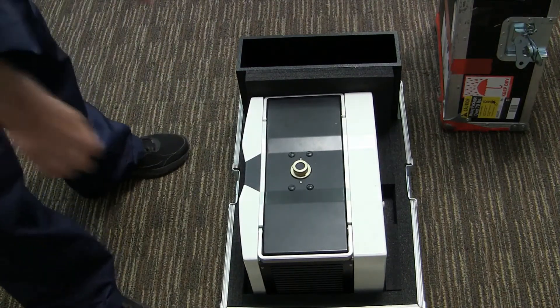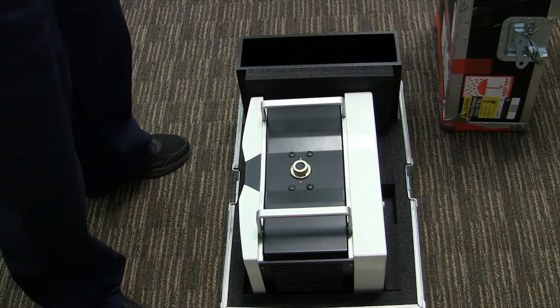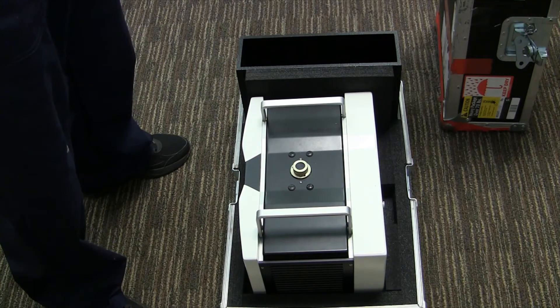Next, make sure you lift the MS-5000 with the two handles using good lifting techniques and two people. The unit weighs about 100 pounds. You want to make sure that you're very careful and have a place to set the unit when you're finished lifting.